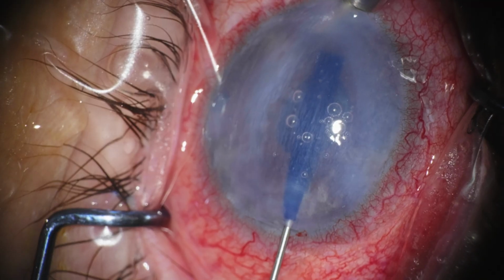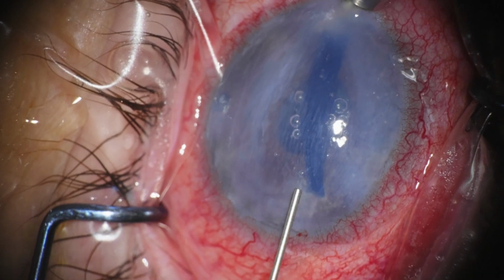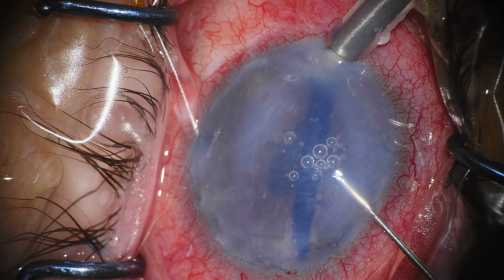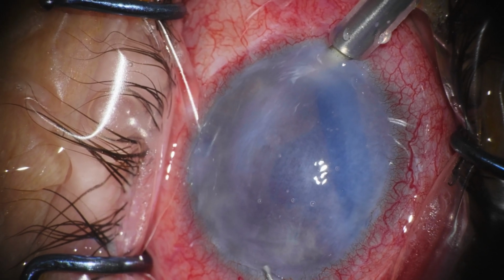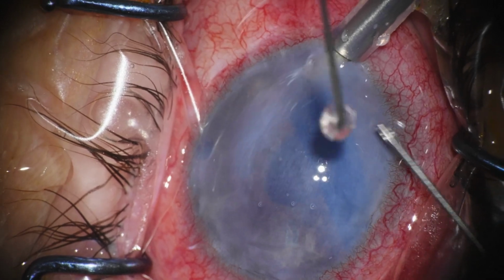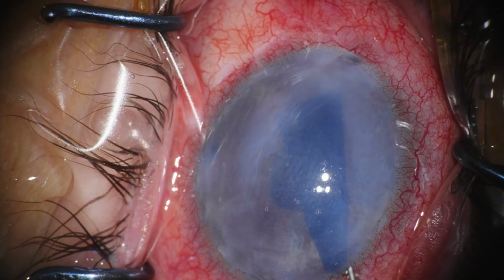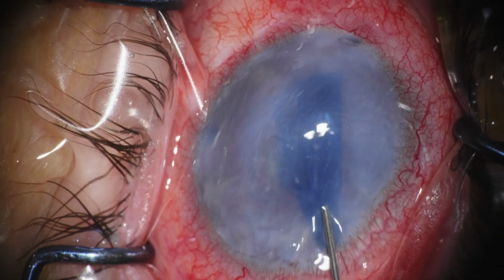So we've injected the graft, which is 9 millimeters, and you can see that it doesn't come close to occupying the whole of the AC white to white, limbus to limbus, and that's because his white to white is about 13 millimeters or close to 14. So now we're using the AC maintainer to be able to have some depth to position the graft, but then we remove it to be able to start unfolding it.